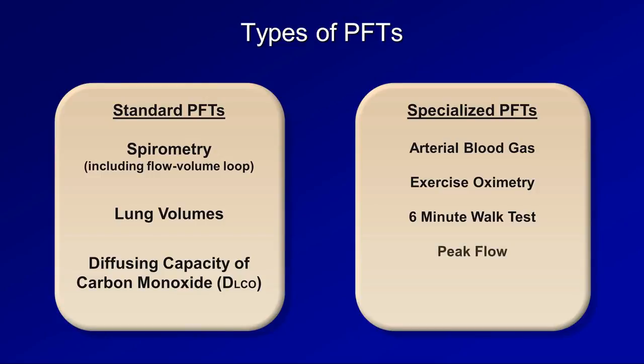The bedside peak flow is a measure of the maximum expiratory airflow that can be delivered in a single breath, typically used to gauge the severity of an asthma exacerbation. Finally, maximum inspiratory and expiratory pressure can provide a rough estimate of diaphragmatic strength in neuromuscular disease, including predicting risk of respiratory failure during exacerbations, such as an impending myasthenic crisis.